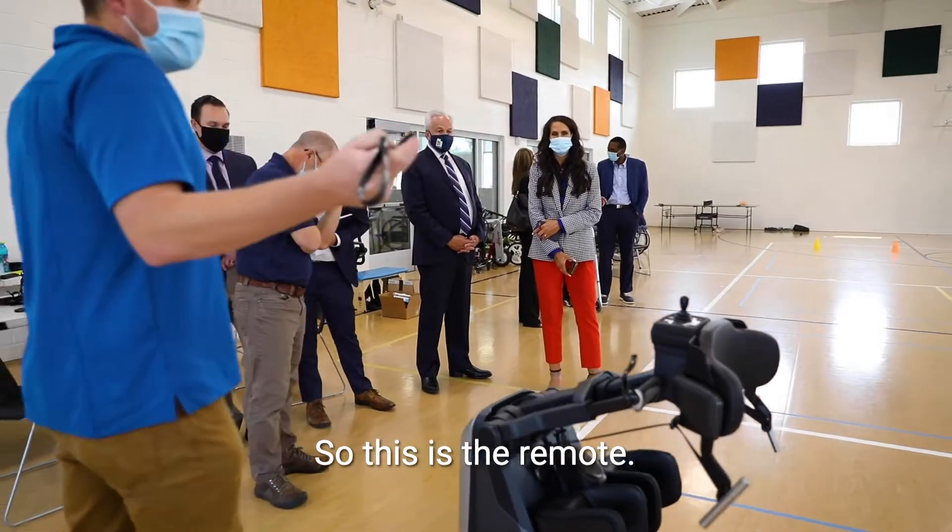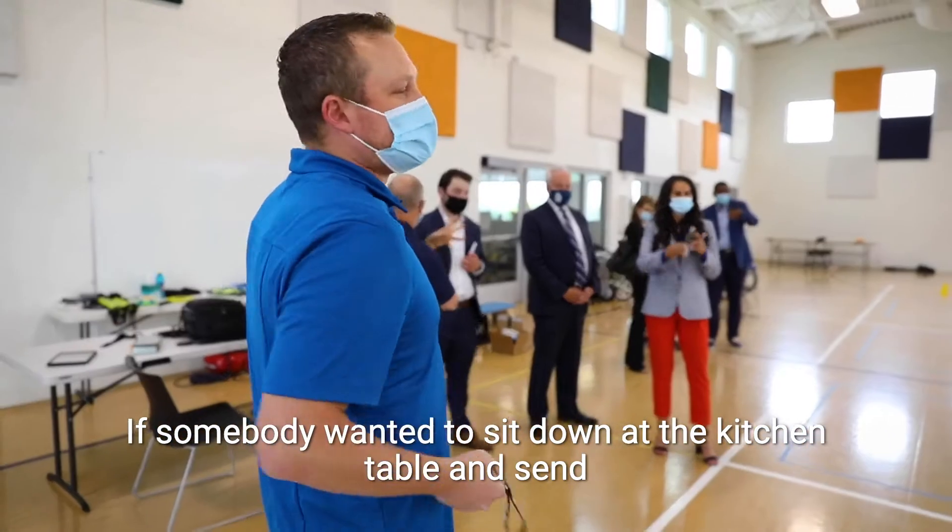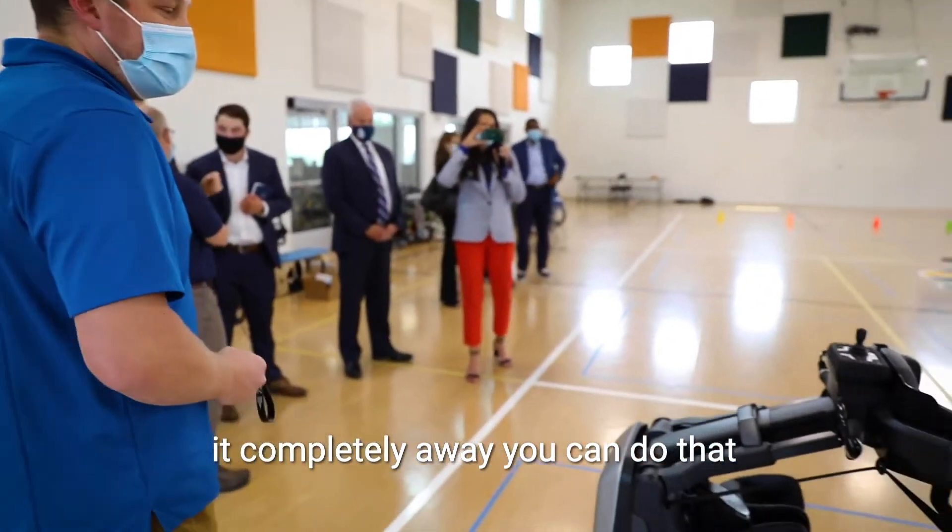So this is a remote. If somebody wanted to sit down at the kitchen table and send it completely away, you can do that.